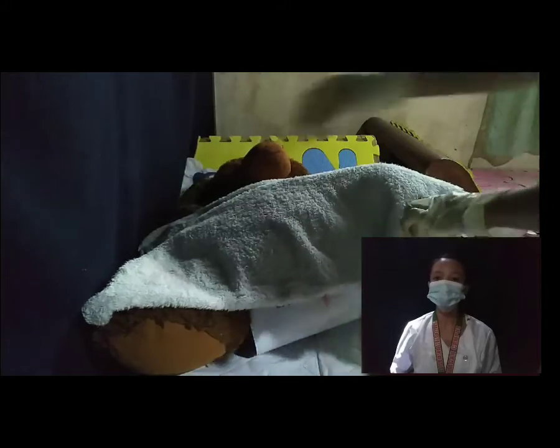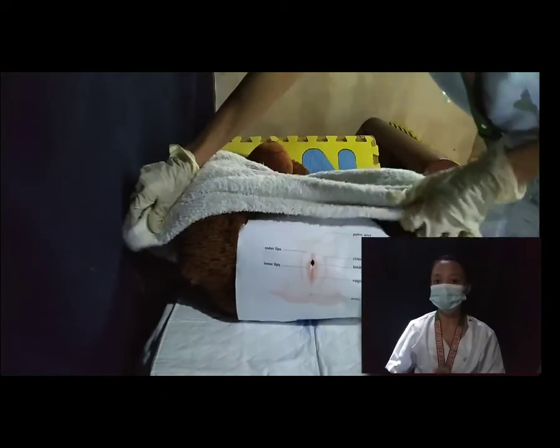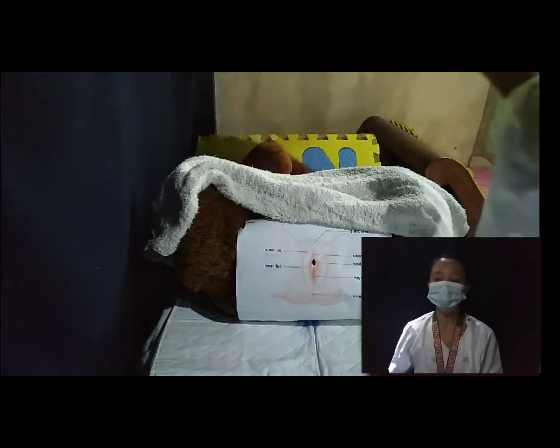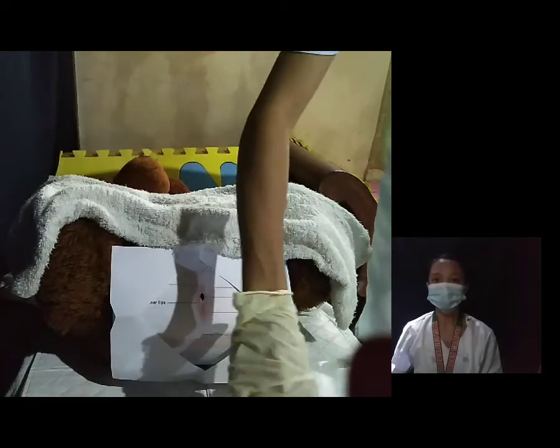Next, we place a blanket or sheet to cover the patient and expose only anatomical areas. This step helps protect patient dignity. Then after placing the cover sheet, waterproof pad, and fenestrated drape, we will now proceed with cleansing the meatus with a cotton ball using the forceps. Using your non-dominant hand, we're going to spread the labia and clean it with a cotton ball. The technique in cleaning the meatus is from farthest to nearest, in an anterior-posterior direction.